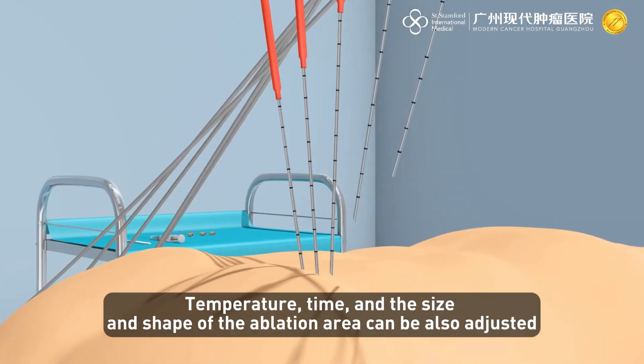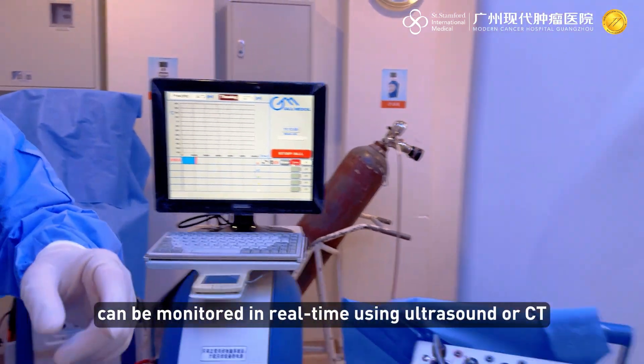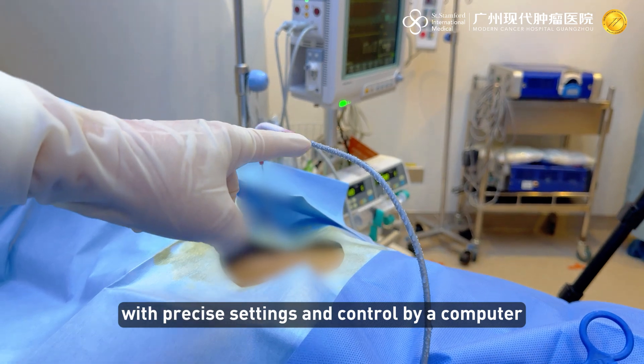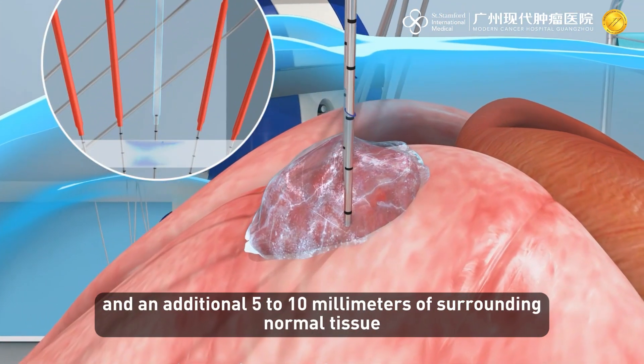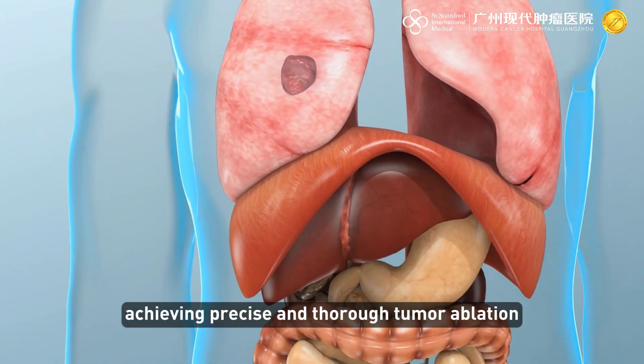The diameter of the cryoprobe is typically small, ranging from five to ten millimeters, and the number of needle insertions can be adjusted based on tumor size, temperature, time, and the size and shape of the ablation area. Argon helium cryotherapy can be monitored in real time using ultrasound or CT, with precise settings controlled by a computer, ensuring accurate coverage of the entire tumor and an additional five to ten millimeters of surrounding normal tissue for thorough ablation.